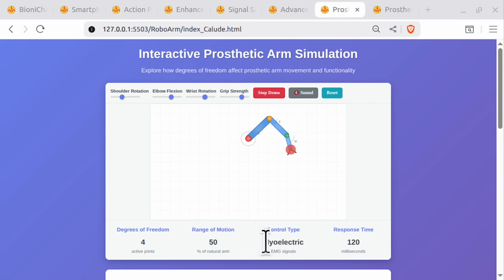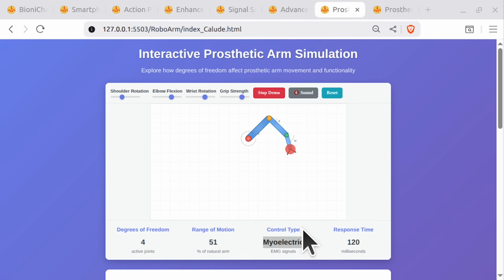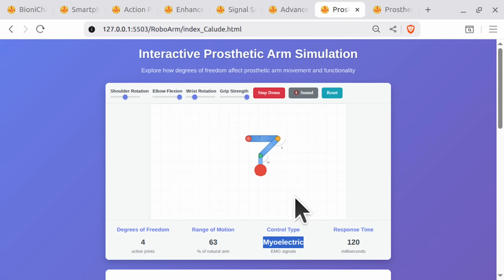Okay, so with the myoelectric control at the moment, what's the relevance of that indication for the simulation? We cannot change it, can we? Can you elaborate on that? So if the control type is myoelectric at the moment, what's the relevance of that indication for the simulation? Also, you mentioned we can't change it, can we? Could you tell me more about that?